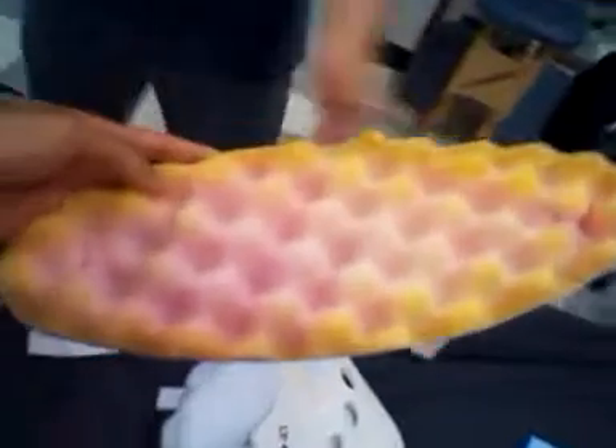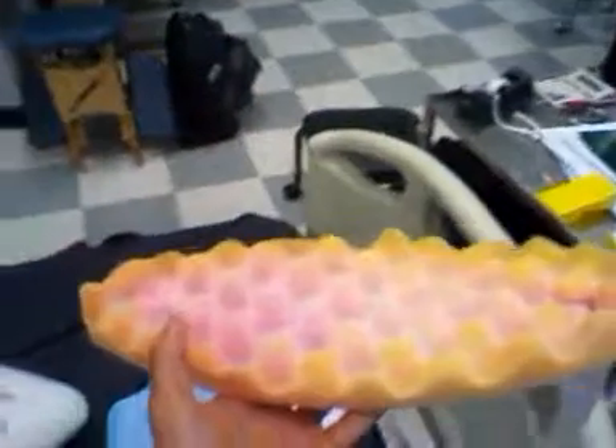What was it called? I don't know, let me find out what it is. Anybody know what this is called? Egg crate. Egg crate.